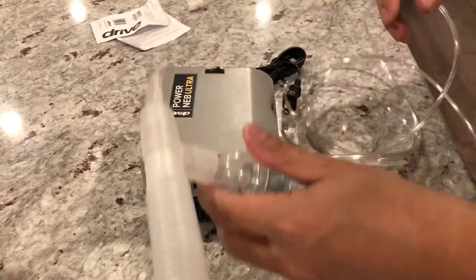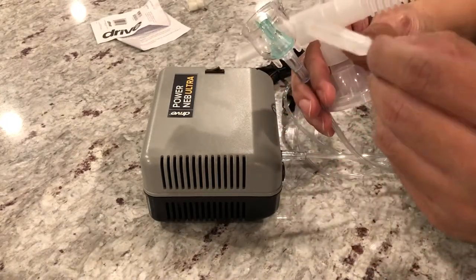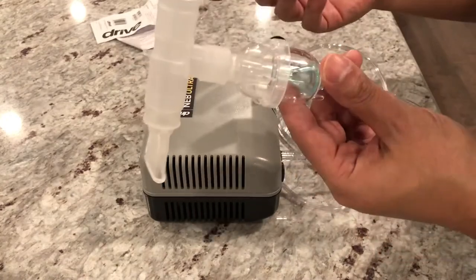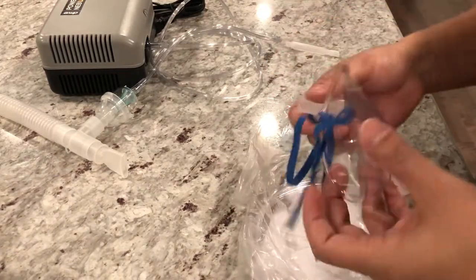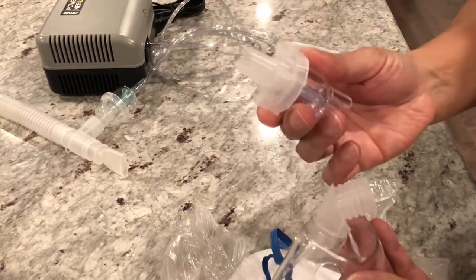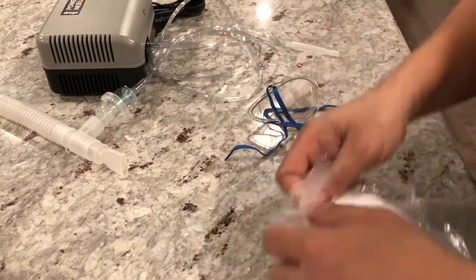And that's it. Basically you just fill the medicine cup with the medicine — one of these vials — pour that in there, put the cap on, and use it like that. Just plug it in, turn on the switch, and that should work. Now, the McKesson kit has the face shield and another medicine cup — same stuff. Since I already have one tube I'm not going to use the extra one.